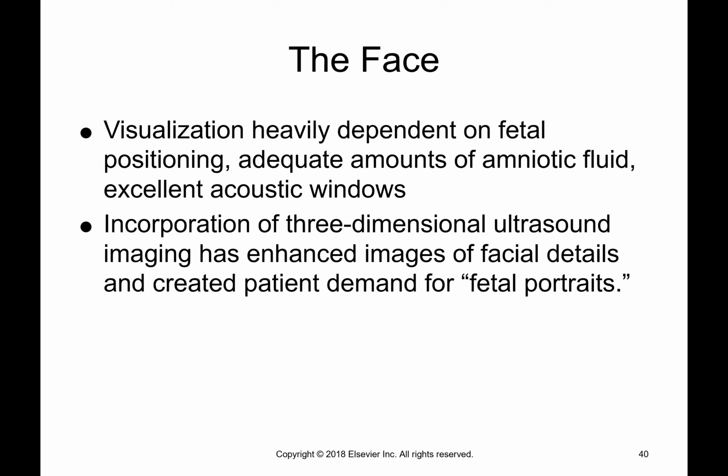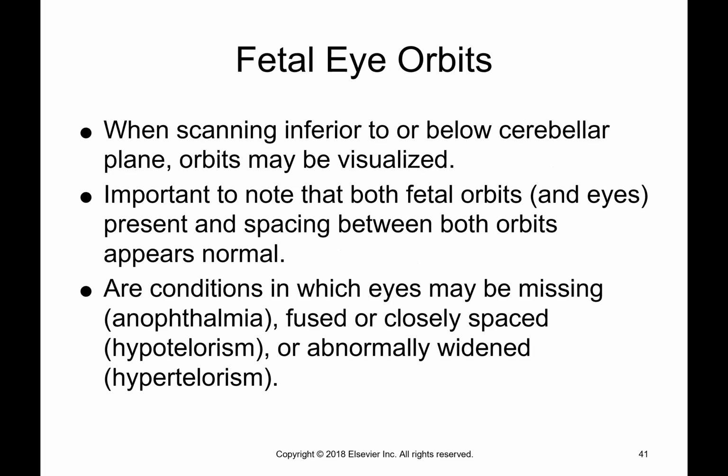Okay, so then we go to the face. The visualization of the face is totally due to the amount of amniotic fluid, if we have any acoustic windows. It just is difficult to get a good face if you don't have much fluid.